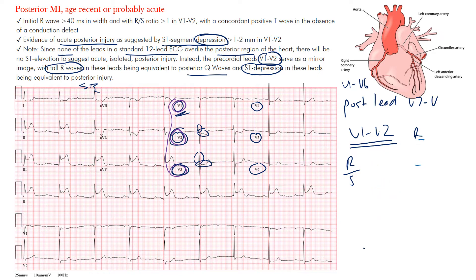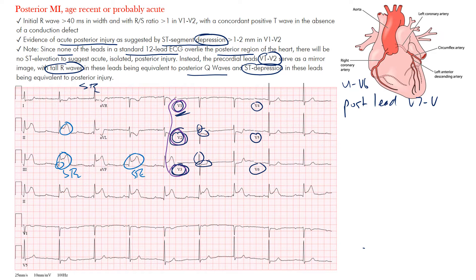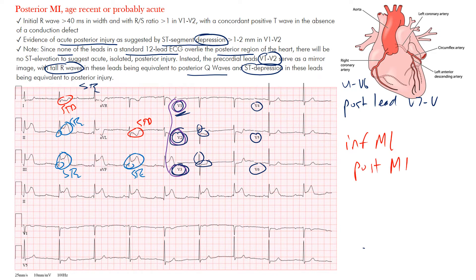Now here's another huge clue visible on this EKG. You have ST elevation, Q waves forming in the inferior leads, and ST depression as reciprocal changes of those inferior leads. Inferior MIs are often associated with posterior MIs, and that's exactly why I put this image of the heart up here.